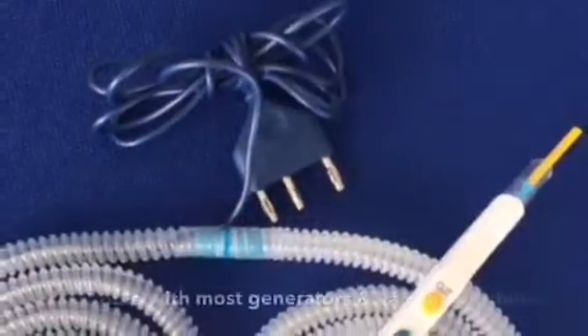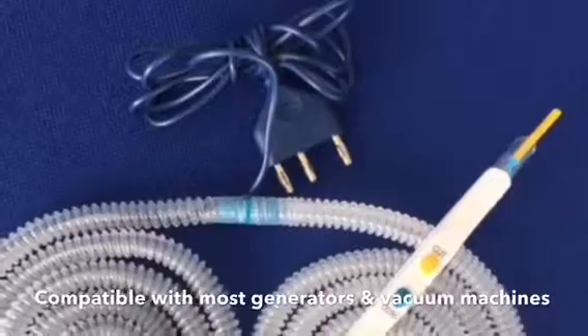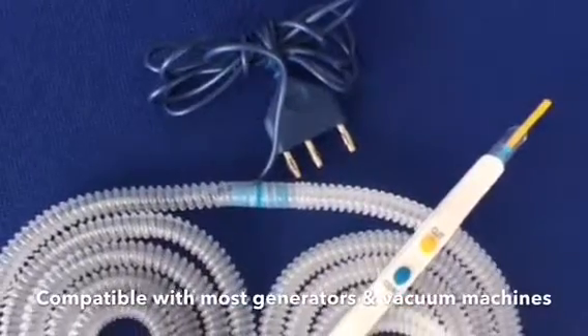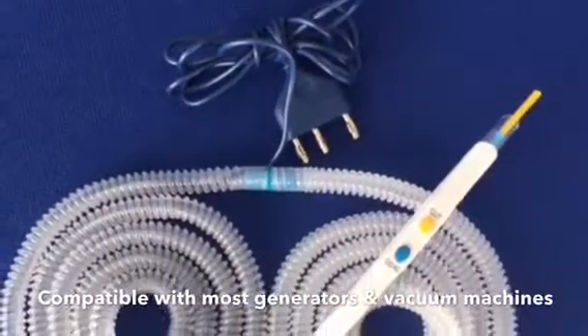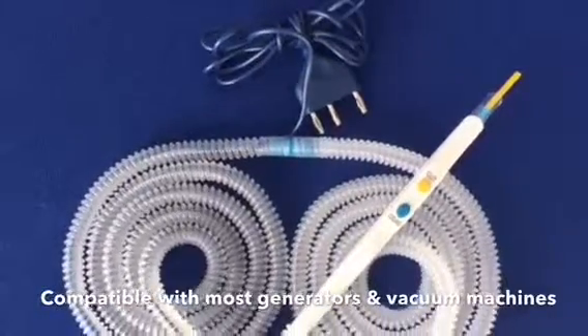The 22mm connector of the aspirator tube and the universal Valley Lab type connector makes the F4797SE pencil compatible with most electrosurgical generators and vacuum machines.